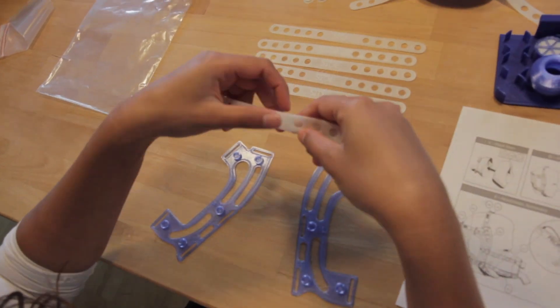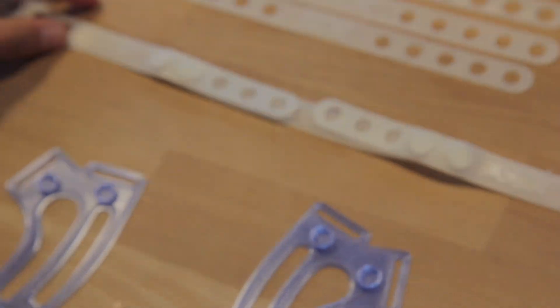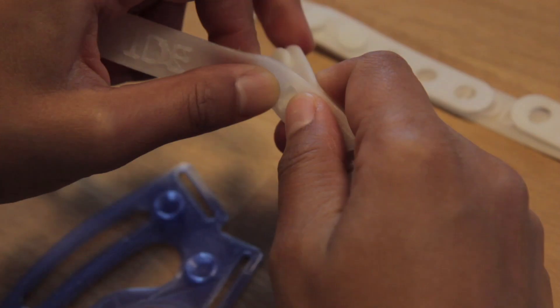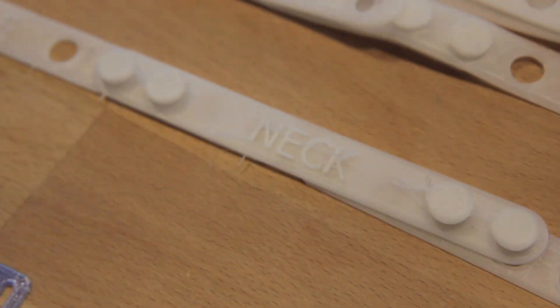Next, take two straps labeled side and connect them to each side of the strap labeled back. Also, connect two side straps to the strap labeled top and to the one with the label neck.